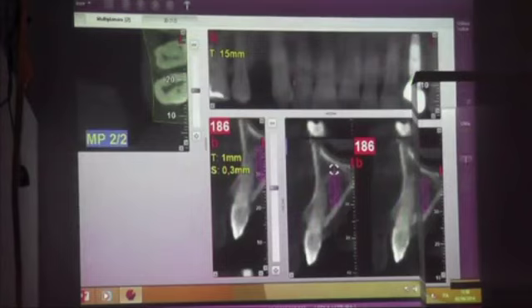This is not a computer adapter, because this is slow. But with a computer adapter, it's quick, you have the image in 3D. In this case we don't have it because it does not support this. And you have inclination, you have diameter, you have everything. And working with this system is very, very easy. Okay?